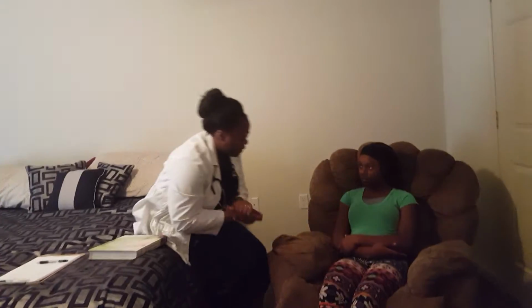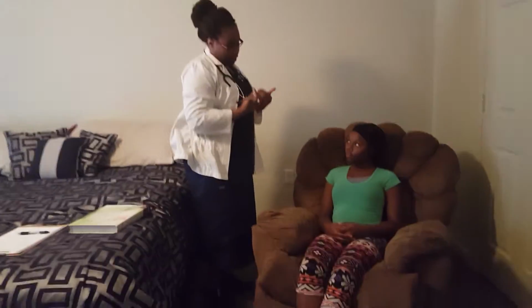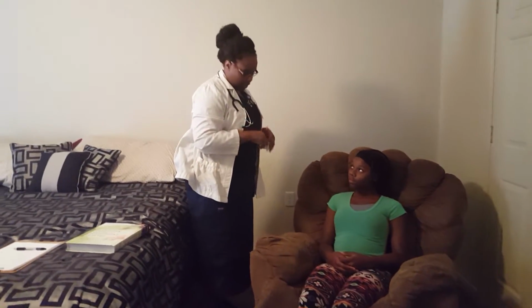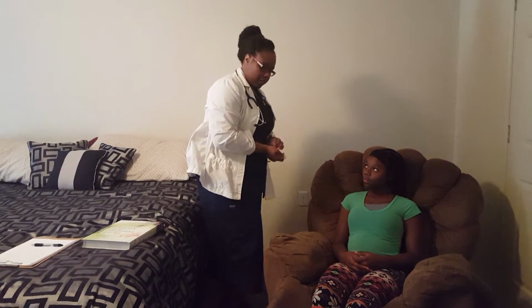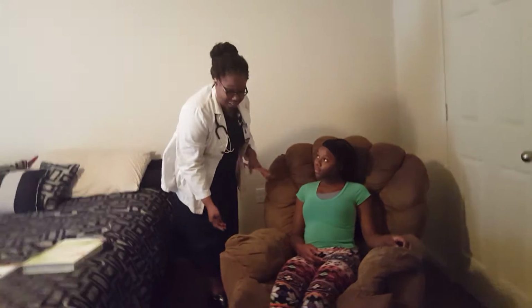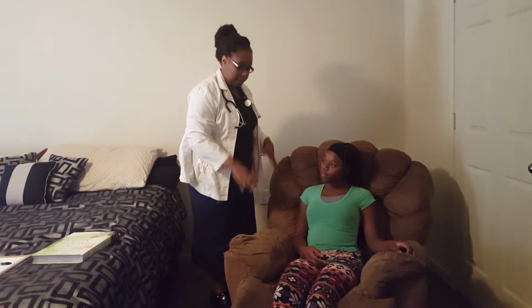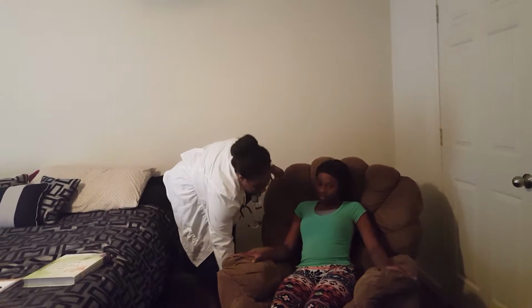Okay. Is it okay for me to listen to your heart sound? Okay, just so you know, I'll be asking you to move your breast tissue because I may not be able to get to the area I need to hear. So just don't feel uncomfortable with that. Okay. And guys, I have a recliner here. If we were in a hospital bed, of course we would raise the bed up to our level and won't be bending over so much. But I'm gonna recline my patient right now.